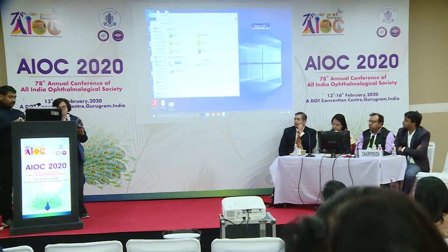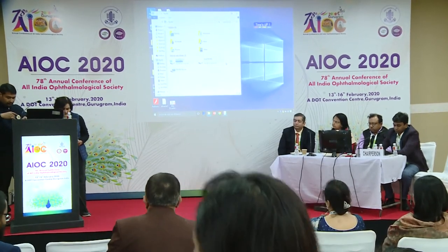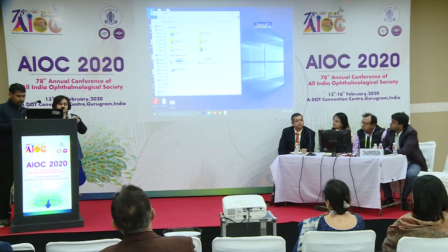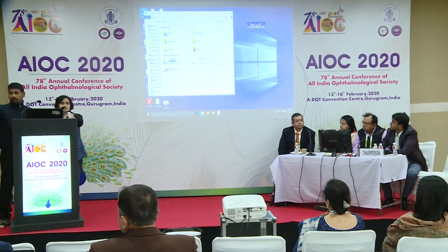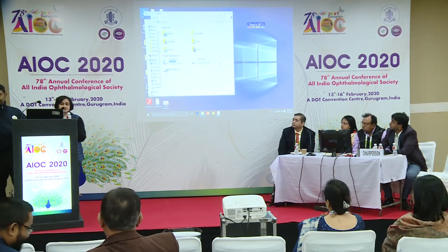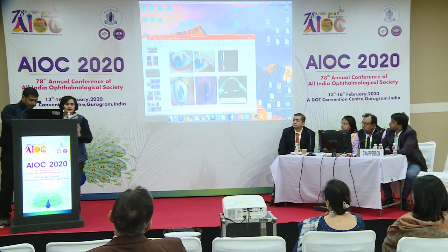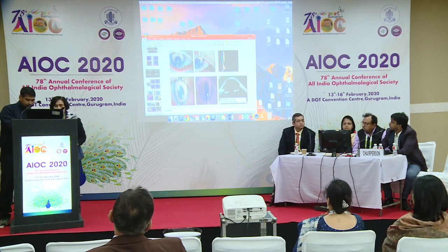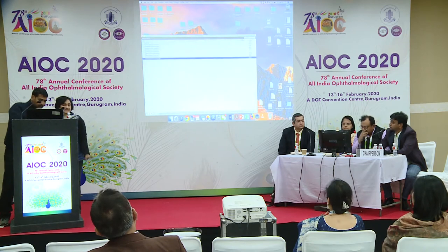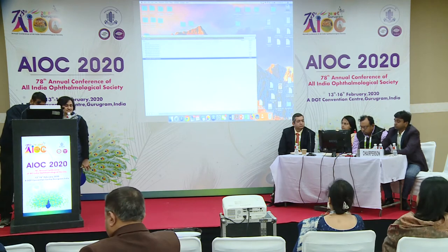I'm sorry I wasted a lot of time, but my topic is DSEK in complicated scenarios. So I'm going to run you through some videos of unusual conditions needing DSEK. The first situation is when I've done DSEK in a case where I had trauma. The first video is a case with trauma, a scleral fixated aniridic IOL and bullous keratopathy.